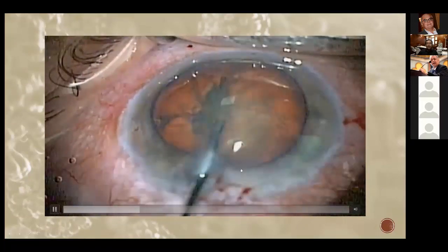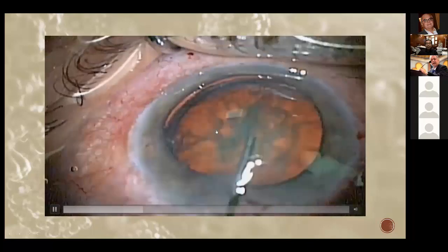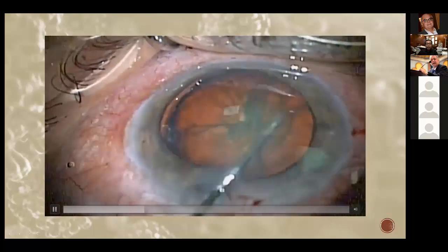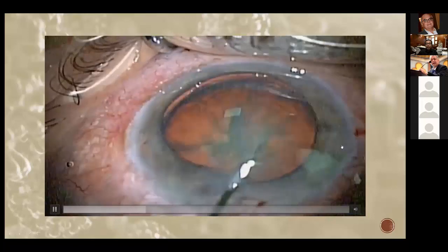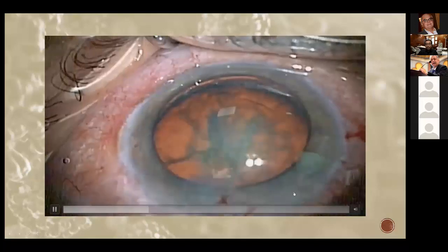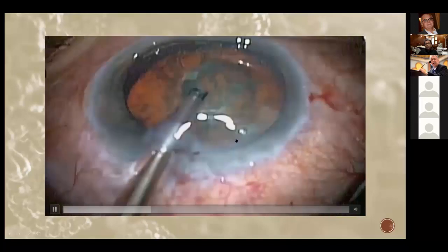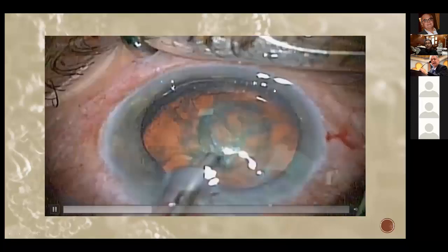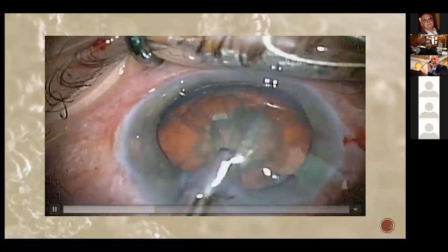So I do my hydrodelineation, it's very important. Every time I'm pushing the nucleus back to its normal position, the pressures are distributed on all the zonules on this side, okay? If I'm pressing to the other side, I will be making pressure on the zonules at the end of the dehiscence.